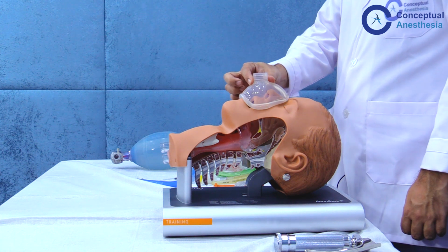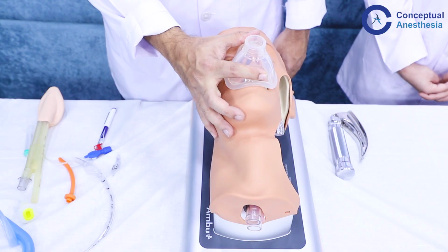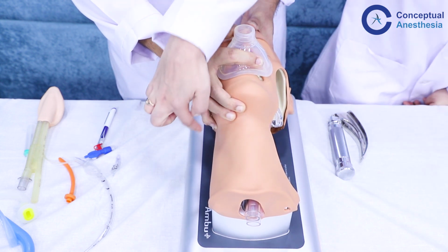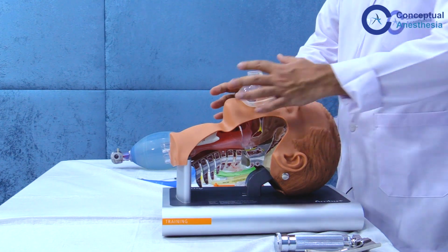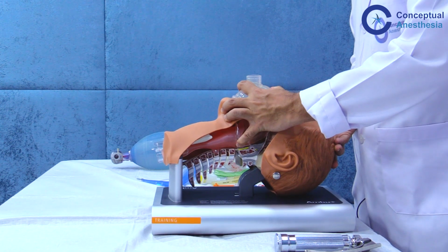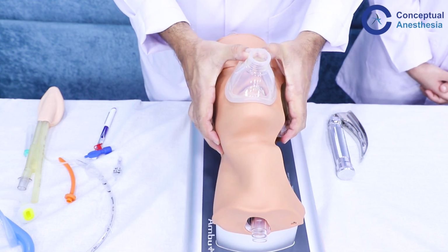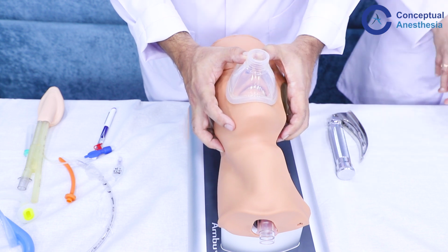The first technique is called the C and E technique, in which you create a C around the mask and the E around the angle of the jaw, and you give a chin lift. Can you see? With these 3 fingers, we are giving a chin lift to open up the airway. Then, if you are not able to ventilate using the C and E technique, the next thing we can use is a jaw thrust. So, in the jaw thrust, we put the fingers on the angle of the mandible and we pull it up and we hold the mask down with these 2 fingers to maintain the seal.